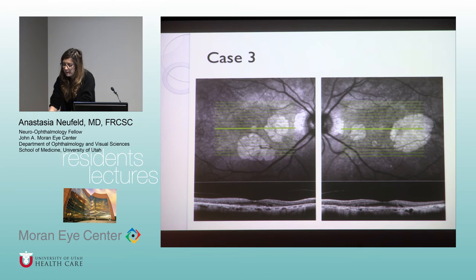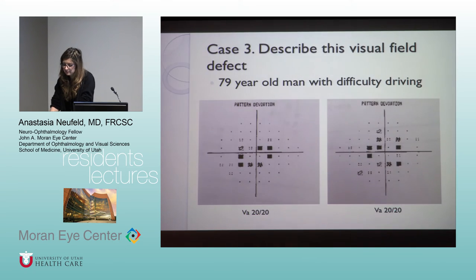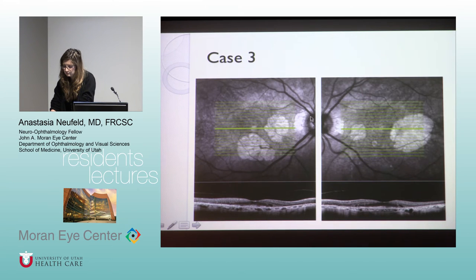I just want to point out again, this is talking about using the physiologic blind spot as an anatomic reference point. You can't really see it very well because it's an absence, but Anastasia, why don't you point out that's where the physiologic blind spot is on that visual field, and then the same thing on the other side. So you could say, okay, the physiologic blind spot is here, and the fovea is here, and on the other side you've got about that same amount of space, so you know that the pathology demonstrated by this visual field is between the physiologic blind spot and about the same distance away from the macula. If you look at that, that's what the central 10 degrees of the 24-2 is representing, this center area within the arcades.